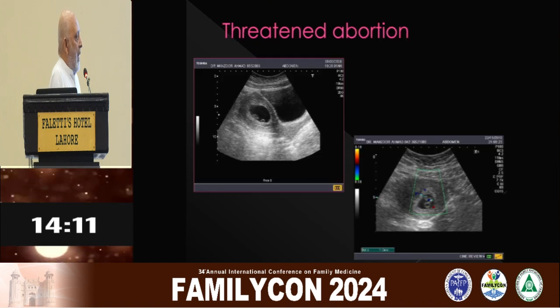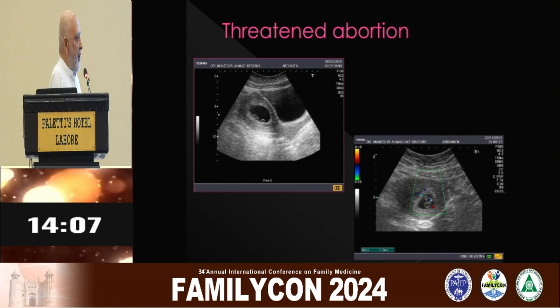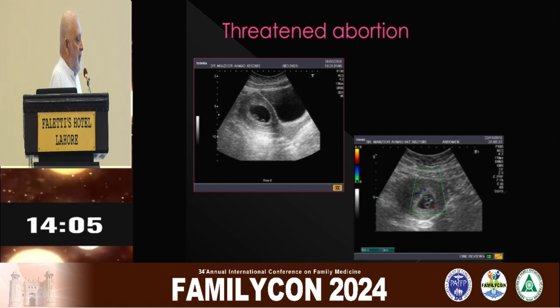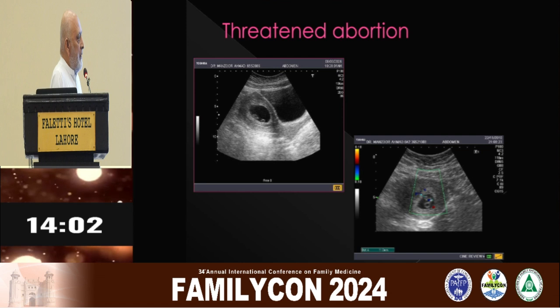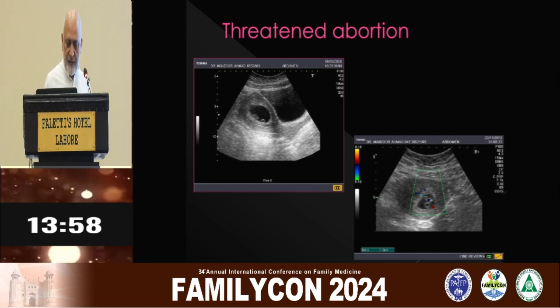You see a gestational sac, and an embryo and yolk sac inside. Here is cardiac activity, but the patient comes with pain or bleeding, so there is a threat to abortion. So it is labeled as threatened abortion.